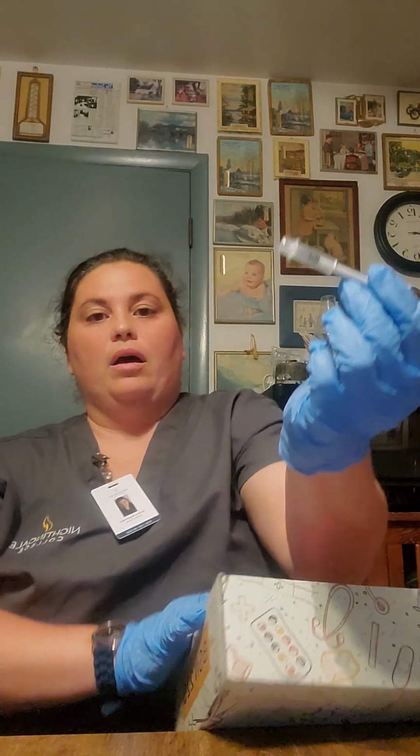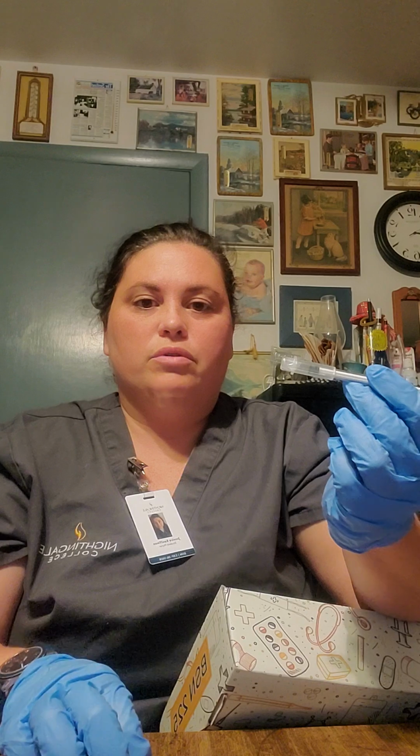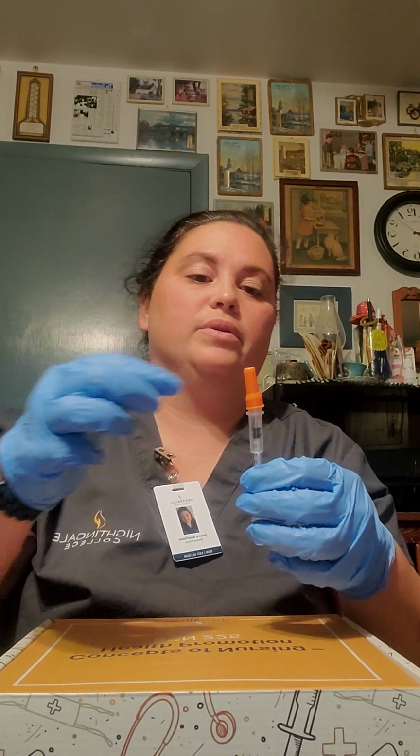I'm going to move this box because I have to do the... Shoot, you guys can't see me. Alright, I would do the scoop method, but I don't know if this cap is going to stay on here. So I'm going to try it here. Alright, I'd scoop it up. Of course, I wouldn't touch the cap with this hand, but... Alright.